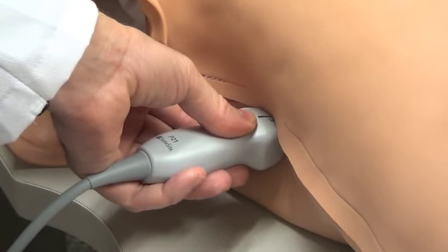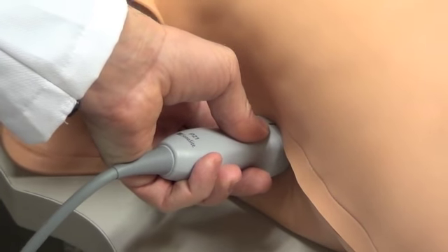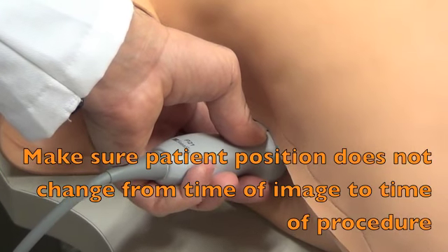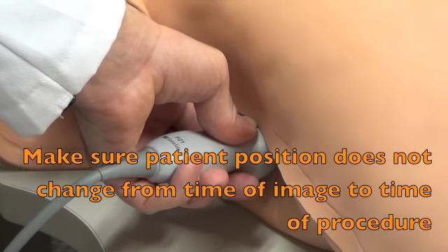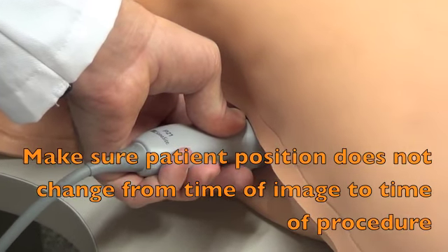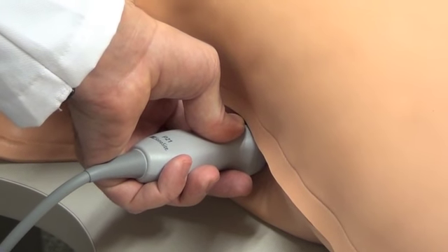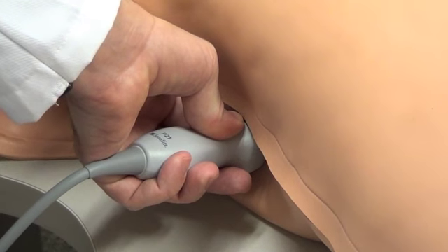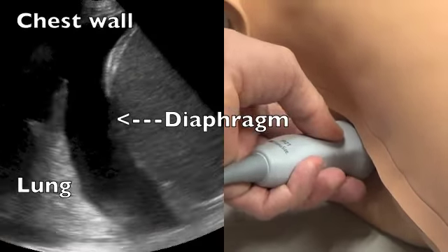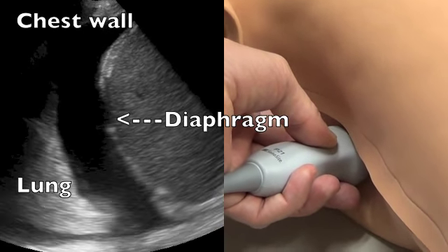Remember that there may very well be atelectatic lung, so always be on the lookout for that on your ultrasound. In this case I'm going to aim a little bit more posteriorly to ensure I do not injure the lung tissue itself or the visceral pleura. The second reason is that this ICU patient is going to be supine, so I want the fluid to collect in a dependent fashion and be accessible with the chest tube. I identify a very good pocket of fluid, as you can see on your screen.